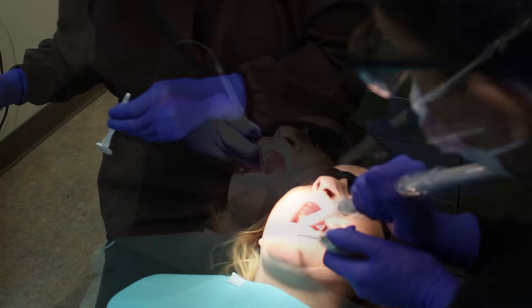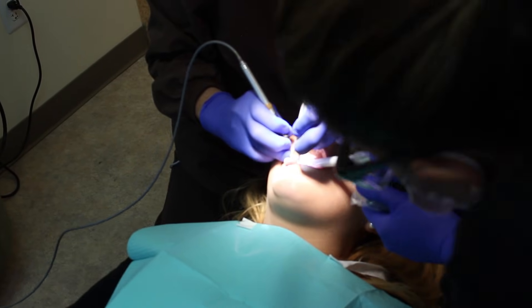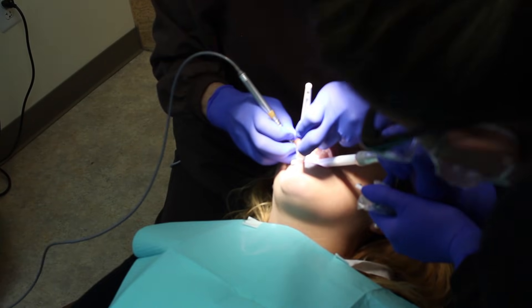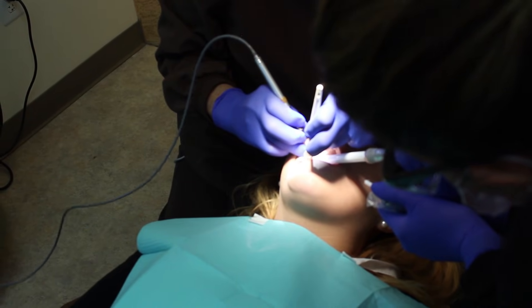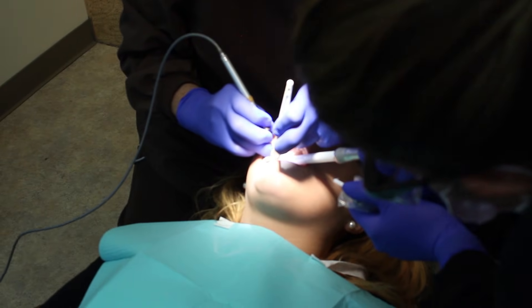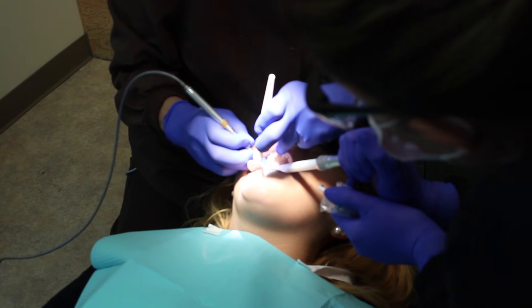I'm going to do a little bit more. We're going to rinse this out and then we're going to take another intraoral photo just to show how we were able to remove the cavity.